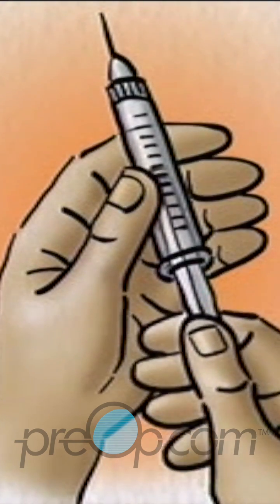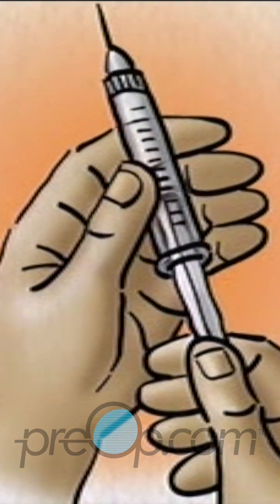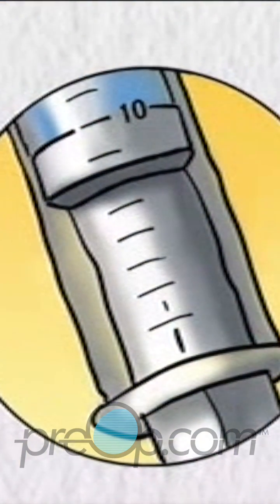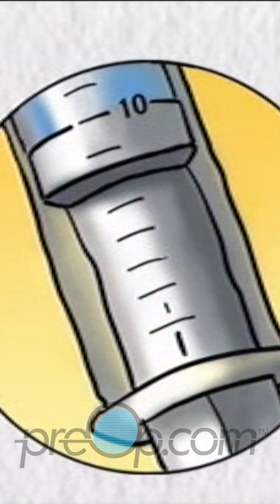Pull back the plunger of the syringe to the dose of the shorter acting clear insulin. In this example, 10 units. You now have 10 units of air in the syringe.